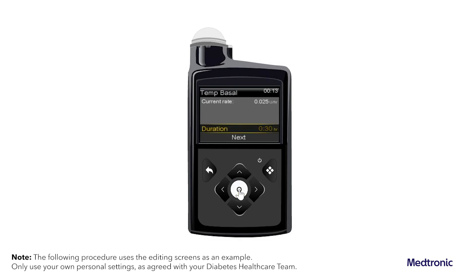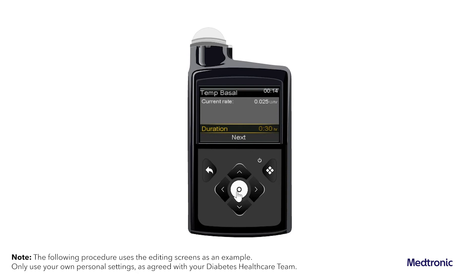Set the duration. Select next. Select type to select rate or percent.